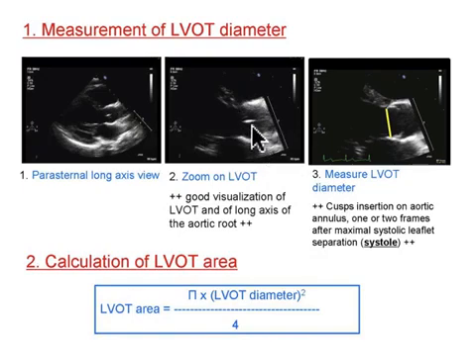The leaflets are together. So in that frozen state, you can then take the dial, bottom left-hand button, and you can rotate that dial counterclockwise, and you'll back up to where end systole was. And those valve leaflets, you'll watch them just kind of march right open. And once they're open at their maximal point, you can take a measurement using the calculations functions between those two leaflets, and that's your LVOT diameter, your left ventricular outflow tract diameter.